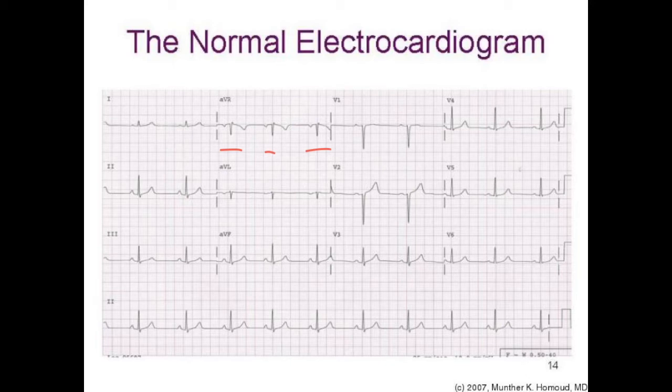Okay, so let's change gears a little bit into some of the practical aspects of obtaining an ECG reading from a patient. To look at electrical activity in a patient, we normally print the ECG tracing, once we place the leads on the patient, on a special paper. It's called ECG paper, and it has large and small boxes, and I'll show that to you on the next slide. But you can see here that if you obtain a 12-lead ECG on a person, you will have all 12 of the leads we mentioned earlier represented, starting from lead 1, lead 2, 3.